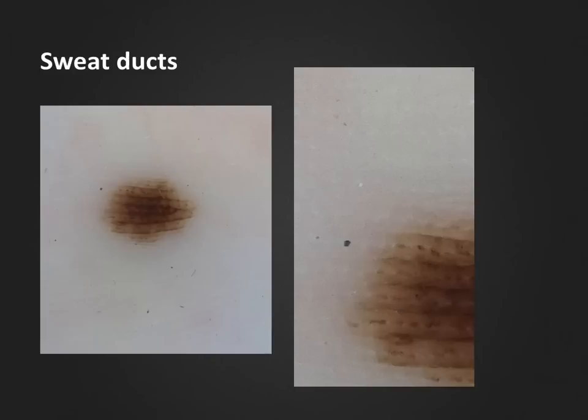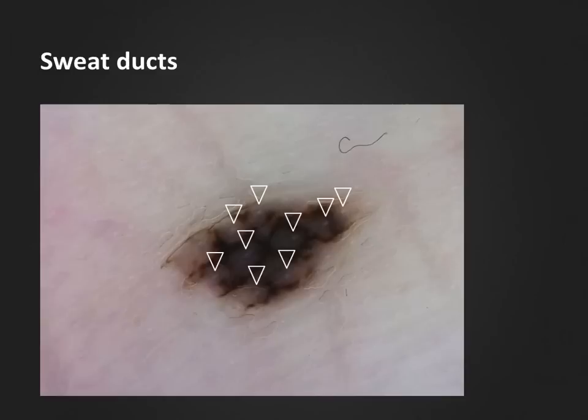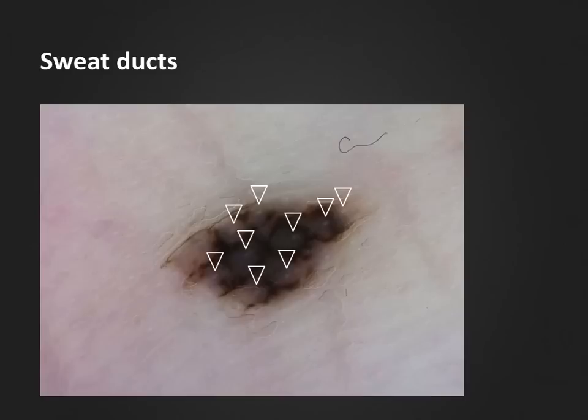We can also find white structures in the normal skin of the palms and soles. Upon dermoscopy of acral skin, we can see the typical furrows and ridges. If we look carefully, we can see hundreds of tiny white dots evenly distributed along the ridges. These white dots correspond to the openings of the eccrine sweat ducts. When examining acral nevi, locating the healthy sweat ducts — as shown here by the arrowheads — can be very helpful. It may allow us to recognize this variation of the benign parallel furrow pattern, known as the lattice-like pattern.